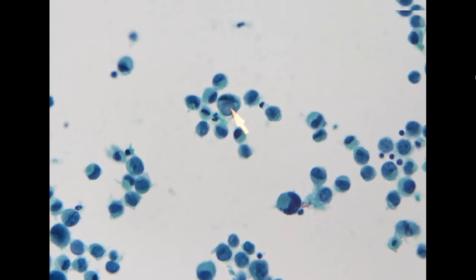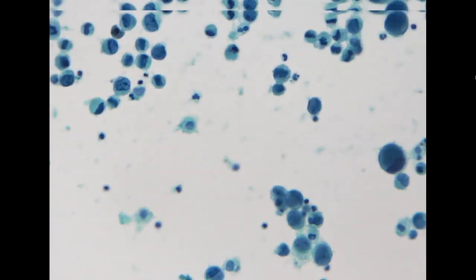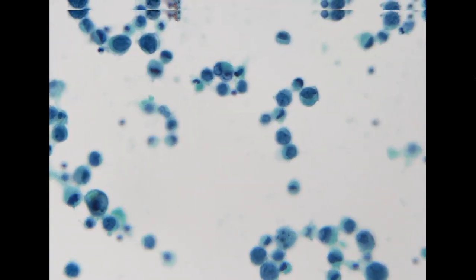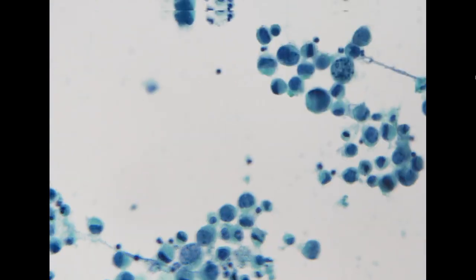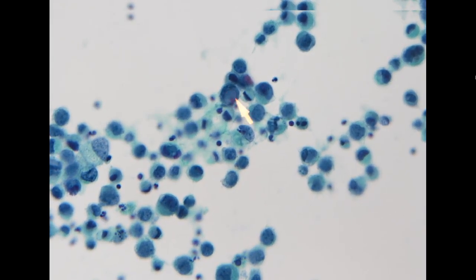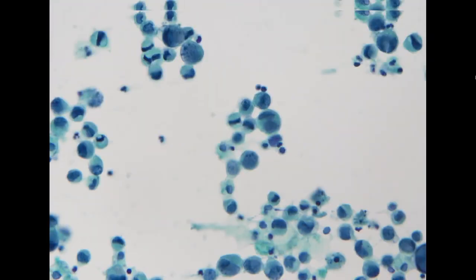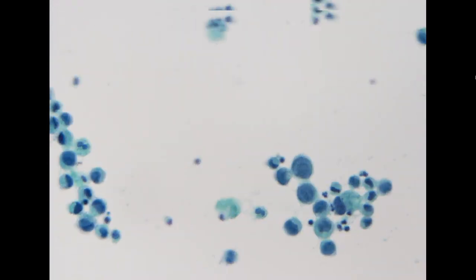So for this case, we have tons of single cells, mostly showing these individual cells, some with a signet ring cell arrangement, and we do see some cells do contain intracytoplasmic mucin material. So the cytomorphology is consistent with metastatic gastric adenocarcinoma.